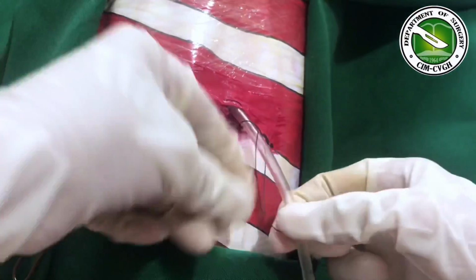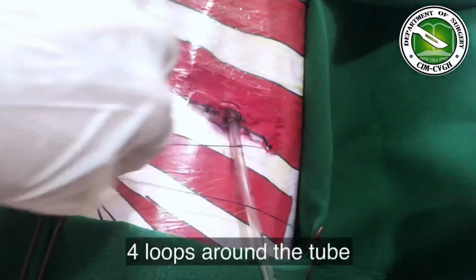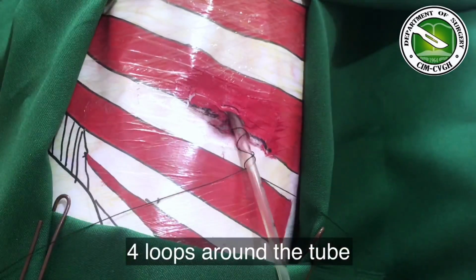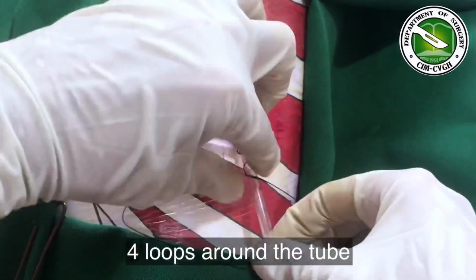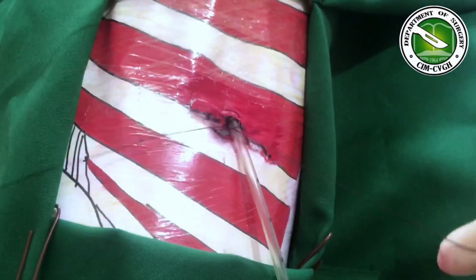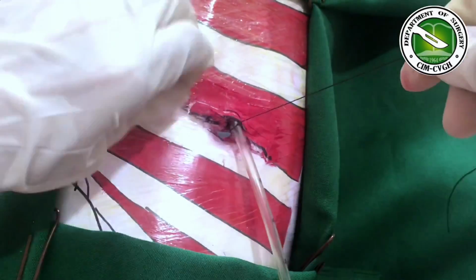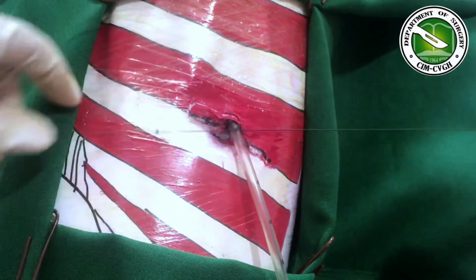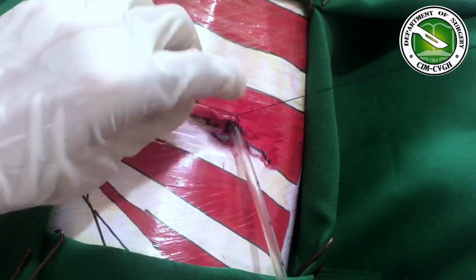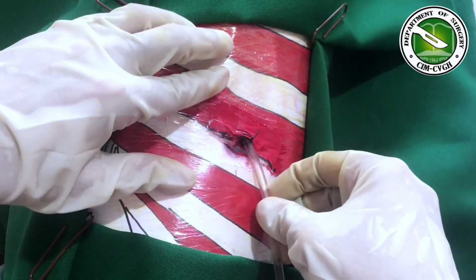Now, wrap the ends in opposite directions around the tube to form a series of X's. Do at least 4 loops around the tube. Push the suture down before tying again to prevent slack from being incorporated into the suture. Assess the strength of the suture.